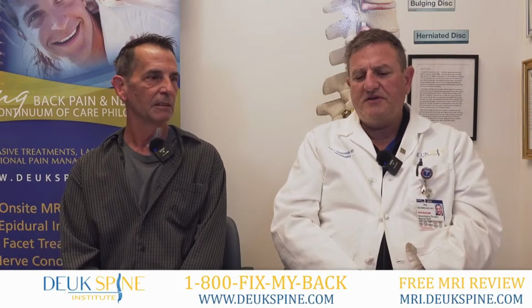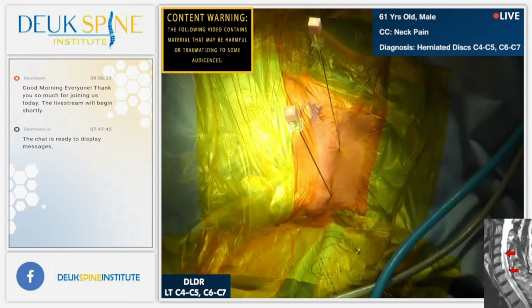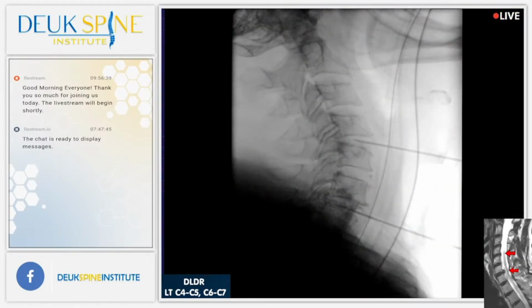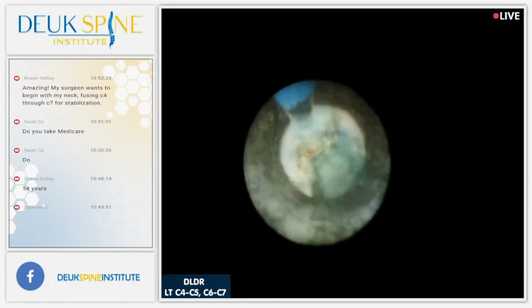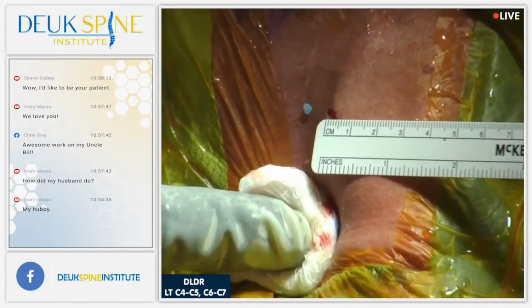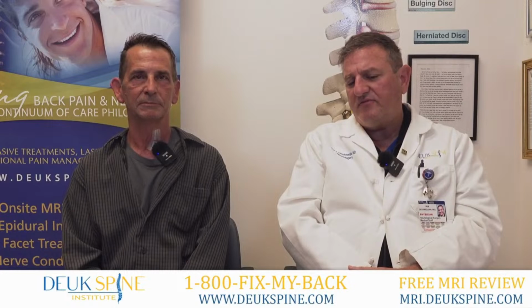Yeah, and you can see in your surgery here, we made a tiny little cut on your neck in 2 spots. 4 millimeters, because you had 2 discs that needed to be fixed or were separated. And we used the laser to remove the herniations along with the endoscope. We did an annular debridement, cleaned up the tear that was there in the back of your disc. Everything went really well. You didn't have to have a fusion, did you?